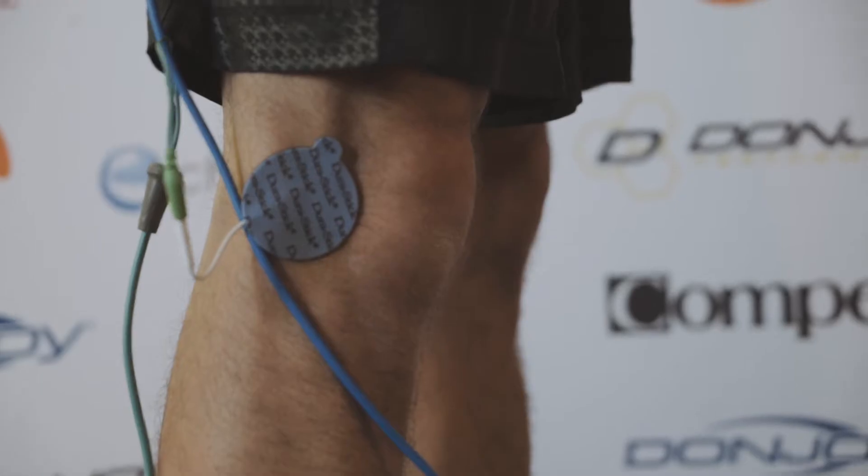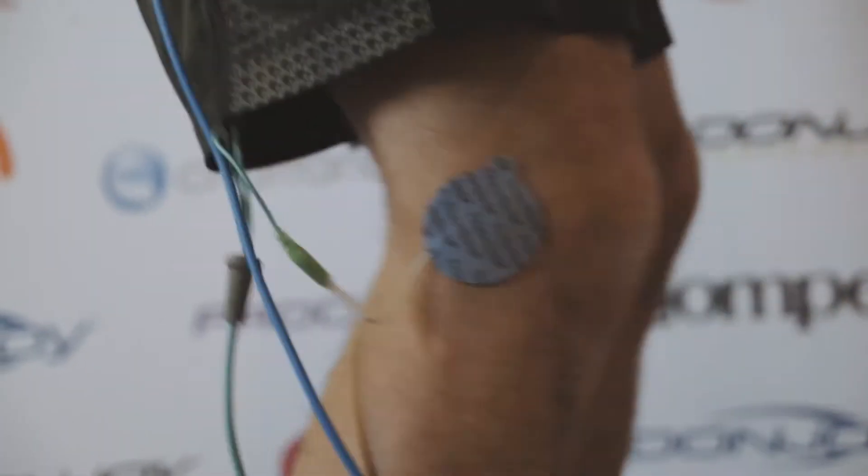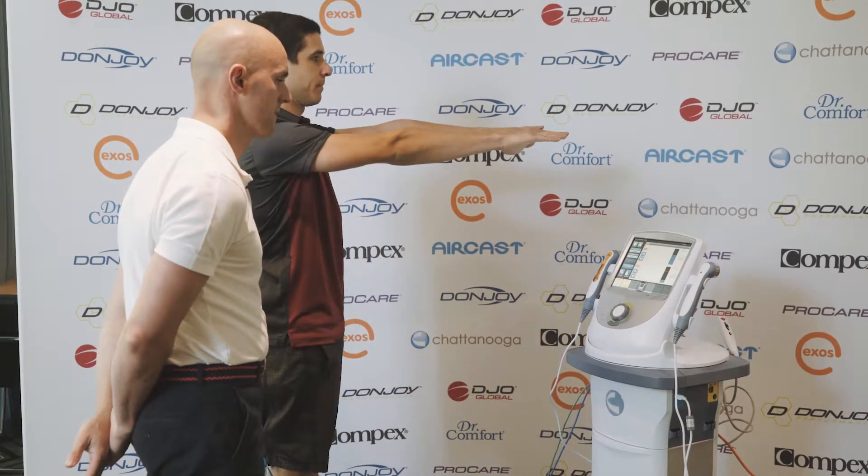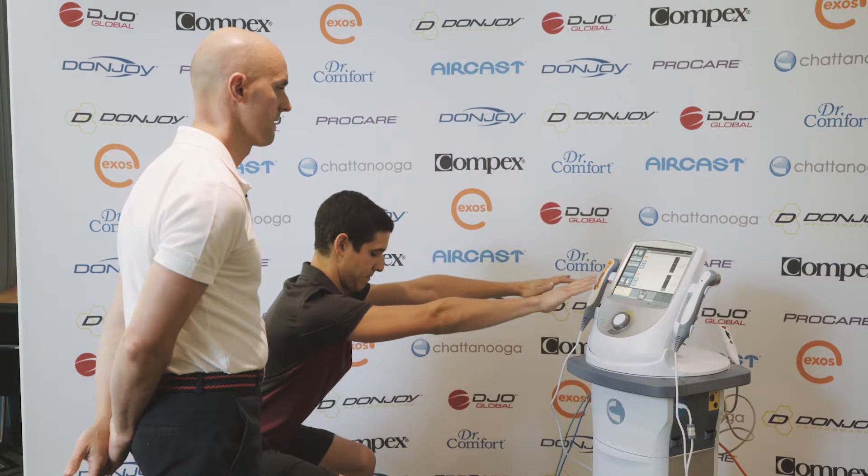Okay, look straight ahead — down and up, down and up, down and up, down and up.